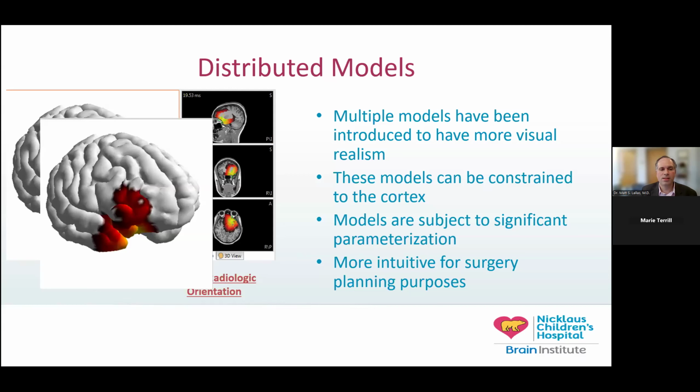And the problem with this is that if we have a lot of user independence in it, and suddenly we start saying, well, this looks true, so this must be the area that needs to come out. And that's not the case, right? This is a statistical test. This is a statistical model of the activity of areas that are likely involved, but it's not necessarily true that you just need to take this whole area and you'll be fine.